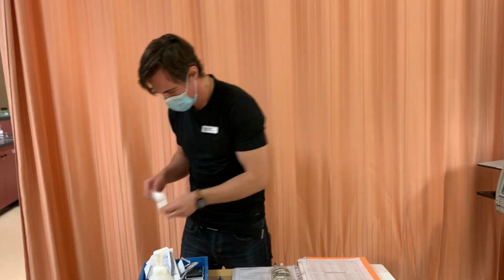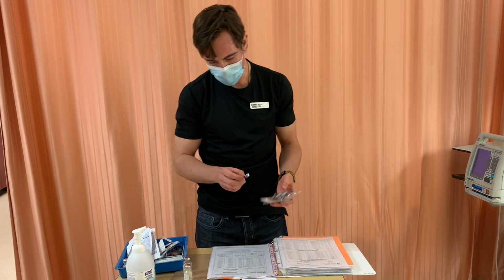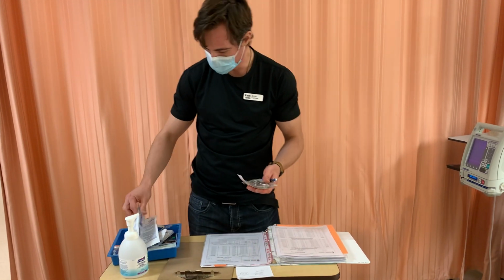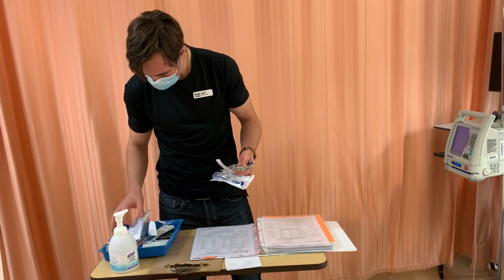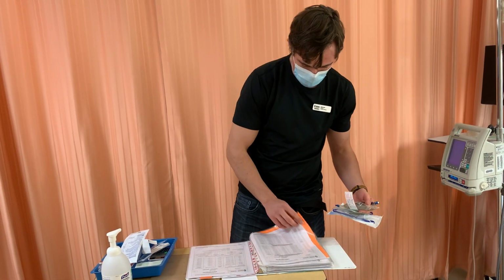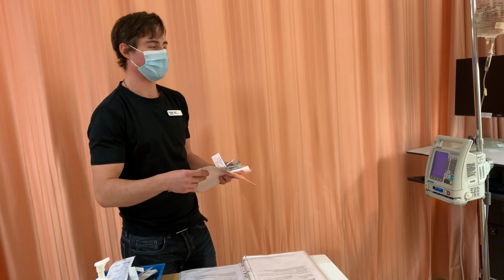So next, I'm going to attach that sticker to my mini bag. Then I'm going to grab all the supplies I need. I'm going to make sure that my medications are away in the appropriate spot. I'm going to grab my secondary set. I've got my medication. I'm going to grab some alcohol swabs and my MAR. Okay, and then I'm going to head over to my patient's room.